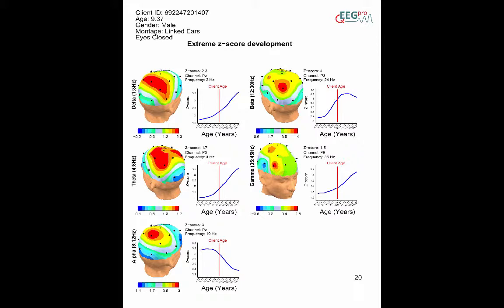On the left plot, the z-scored absolute power of the most extreme z-score within a frequency band is plotted on a three-dimensional head.